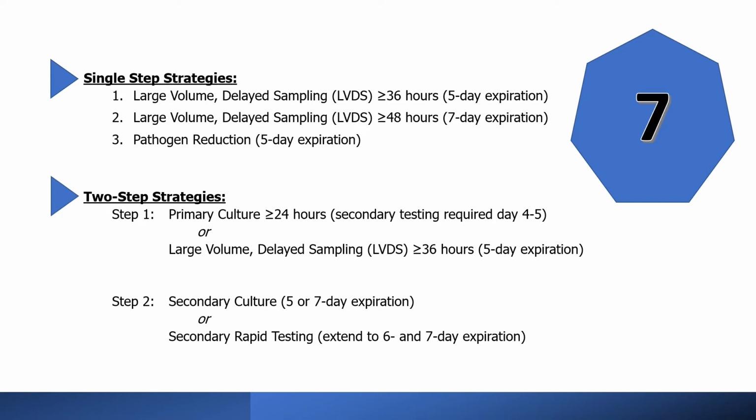Most hospitals prefer the single-step strategies as there is really nothing more to do once the product gets to the transfusion service. However, shelf life, cost, and product availability can be limiting factors. In some rural areas that may be a long distance from blood centers, more flexibility may be desired, and those hospitals may opt for a strategy that will accommodate greater shelf life or shelf life extension.